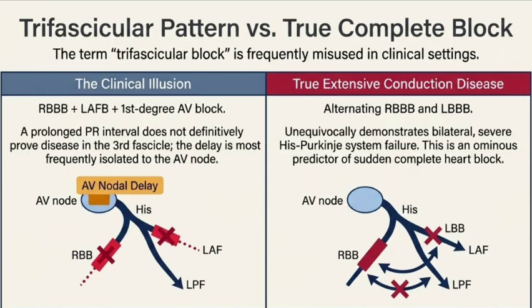So the electricity flows away from the dead zone, pushing the vector up and to the left. Exactly. A doctor has to methodically rule those structural issues out before blaming the wiring. It is a game of clinical elimination. You see the U-turn on the paper, but you have to verify that the detour wasn't caused by a massive muscular wall or a crater of dead tissue before you blame a broken wire. That is the exact diagnostic process, yes.